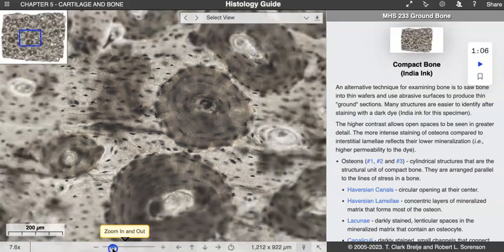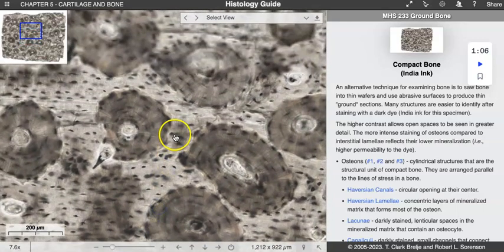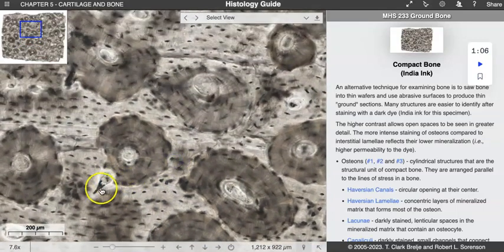And even if I zoom back out here, let's go up to the top. Just take a moment. What do you think that is? That is going to be a little snippet of a Volkmann's or a lateral canal. Remember, these are all blood vessels traveling out of the screen towards you or going into the screen, so we're looking down like the top of a straw. We also have a very perpendicular system of these bigger canals, these channels that are going at 90-degree angles.